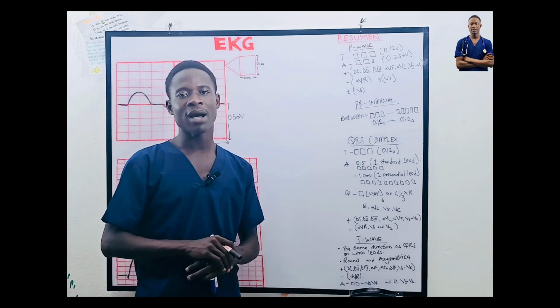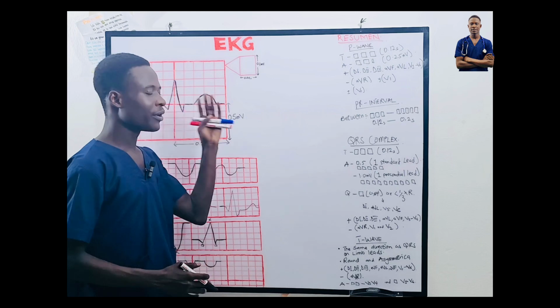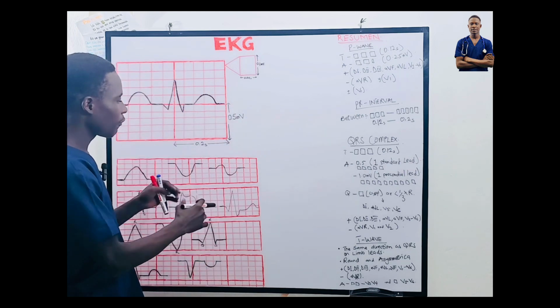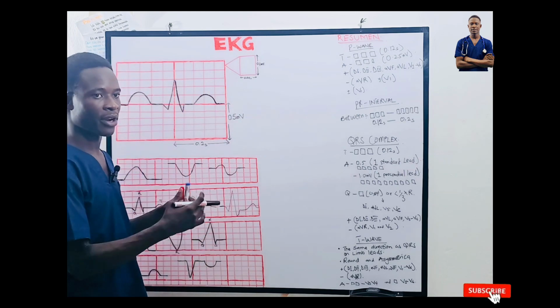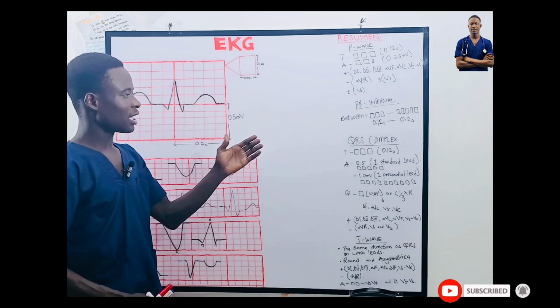Hello guys, welcome back to the Lectures Desk once again. Today we are going to talk about reading of EKG: how the 12-lead EKG can be read. Do you understand? Now, let's look at something here.